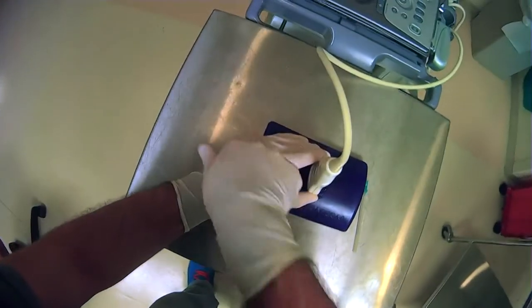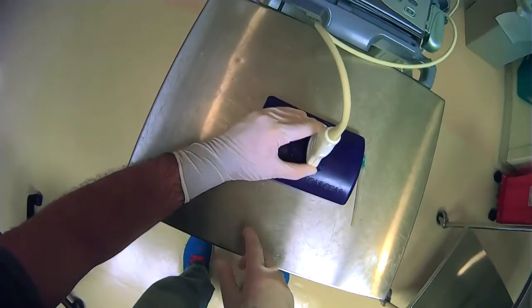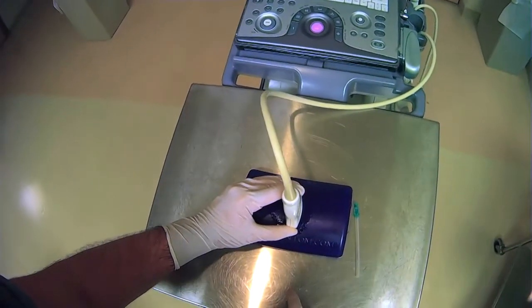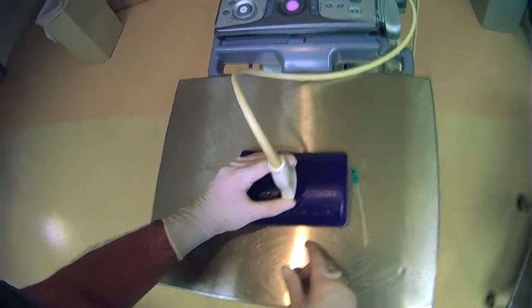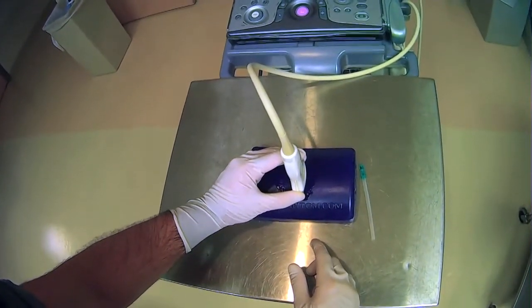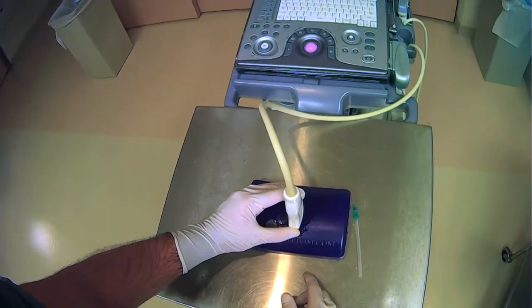And again, you can rest your hand right here so it's not floating in space. And you have a very stable ultrasound probe because of what you're doing.